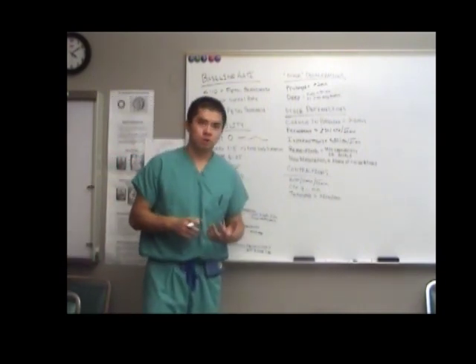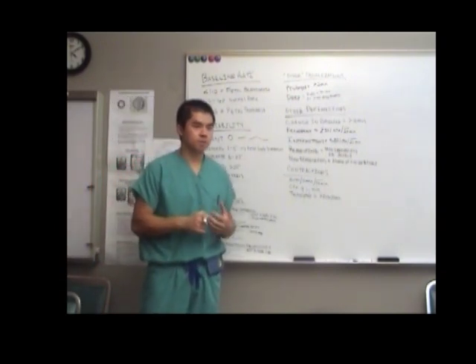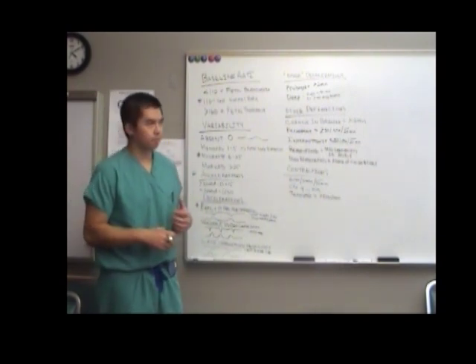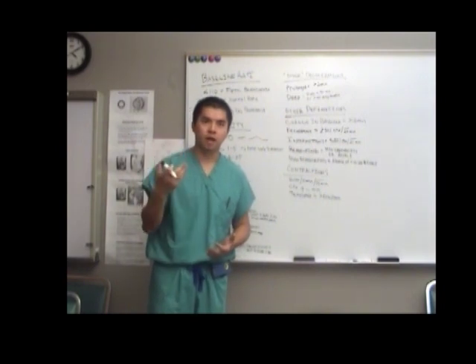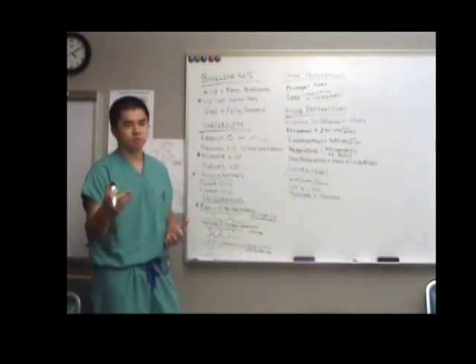So to be more descriptive, you can say we just had a prolonged deep decel down to the 60s for about 4 minutes, which has now recovered back to the baseline of 120s. Now, I could picture that in my head and redraw that probably exactly as you're seeing it.